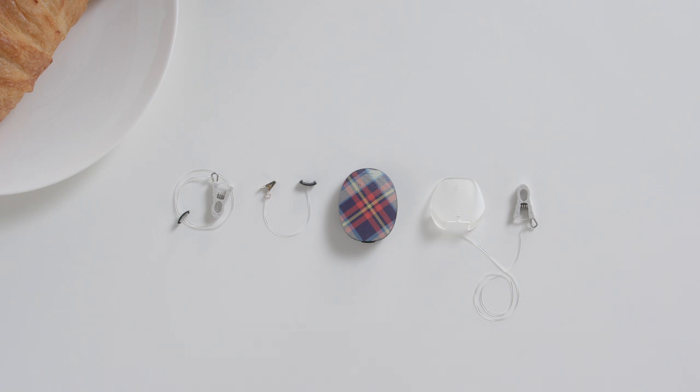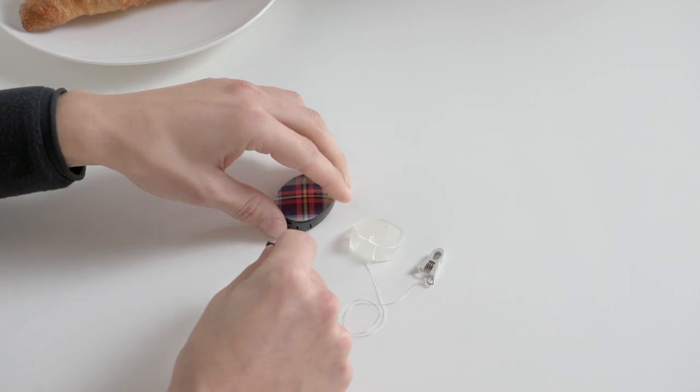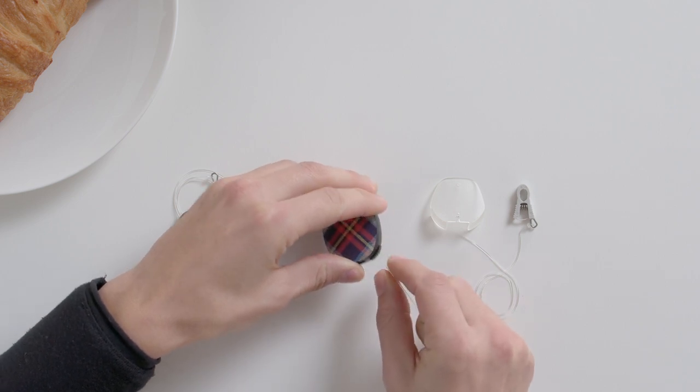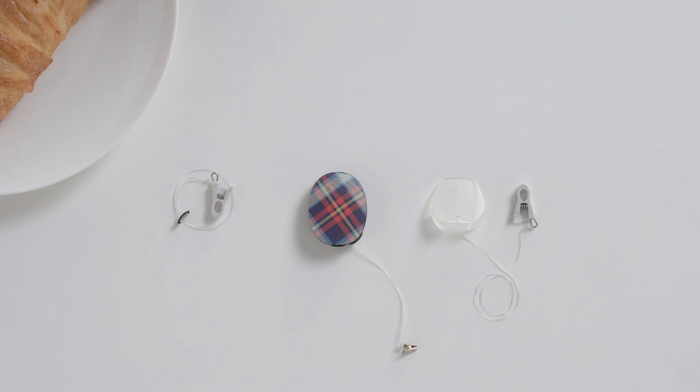To attach a clip with a bracket, position the bracket over the grooves on either side of the rubber socket cover. It does not matter which side you attach it to. Push one bracket lip into the groove, then press down on the other side until it snaps into place. You can now clip your RONDO 3 to your hair or clothing.